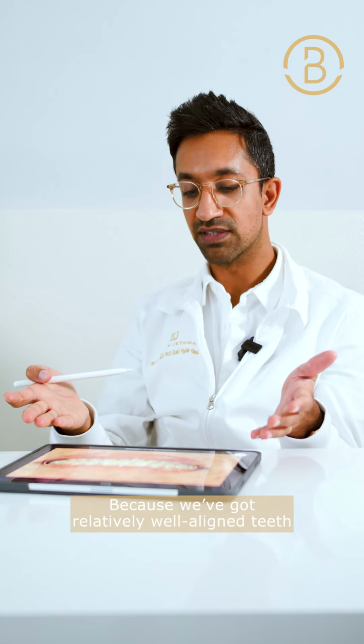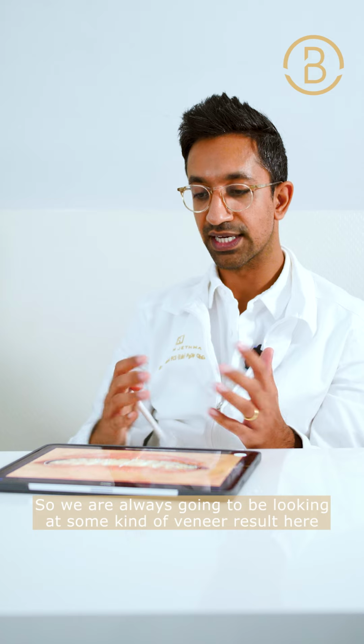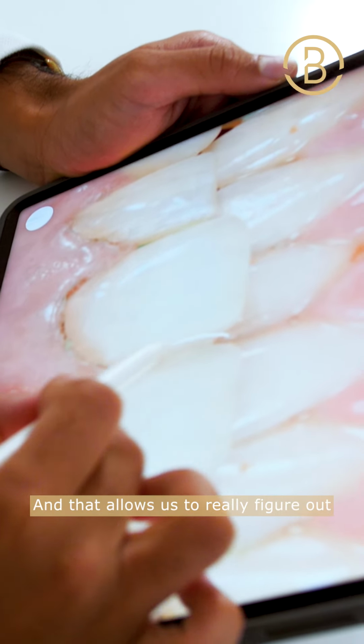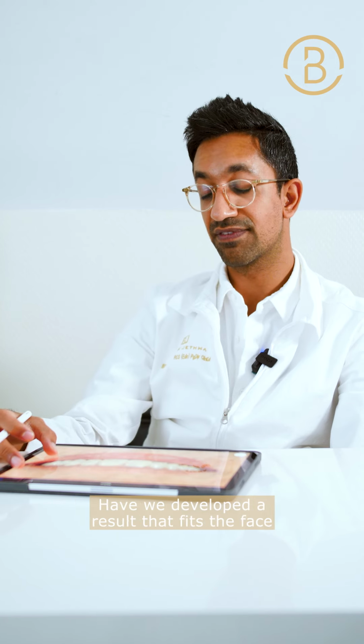Now, obviously, orthodontics is going to achieve nothing here because we've got relatively well-aligned teeth, and actually it's the proportions we need to change. So we are always going to be looking at some kind of veneer result here. First step, as always, is get my patient into handmade temporaries, and that allows us to really figure out, is this case going to be minimal? Because we're adding to the teeth and we're seeing, have we developed a result that fits the face?